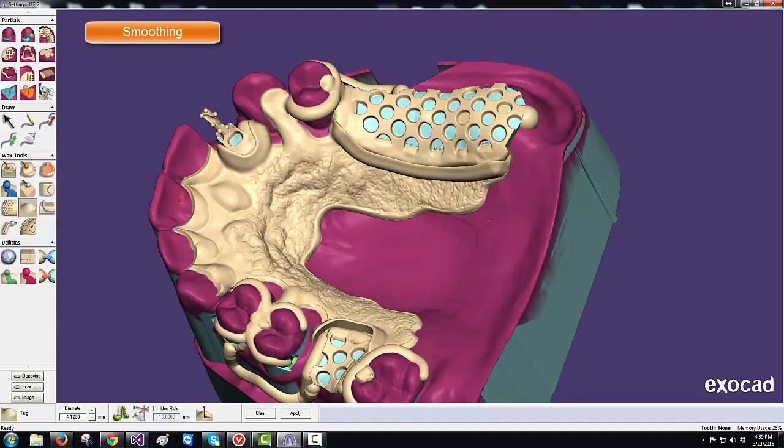If you see any holes you want to reopen, then you can use the smudge tool, set the area of influence to the right power that you want, and just remove any wax that was placed in those holes from overlapping.